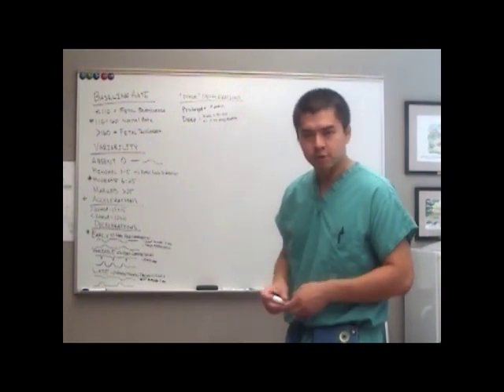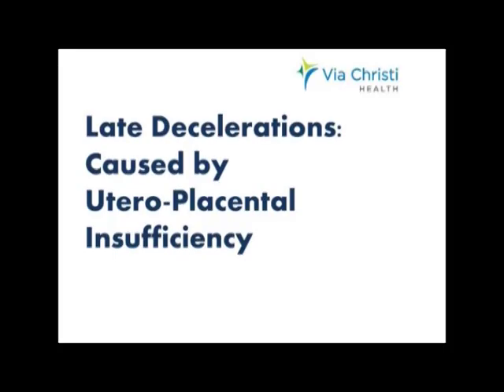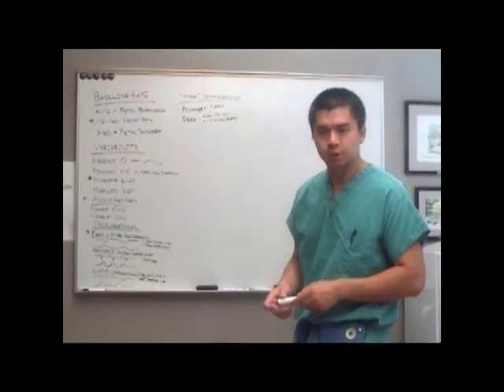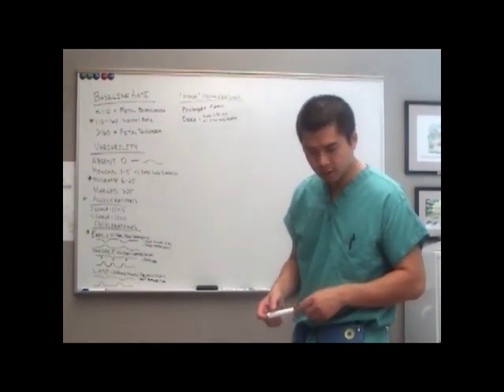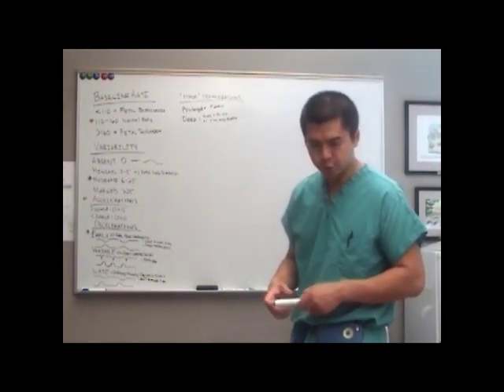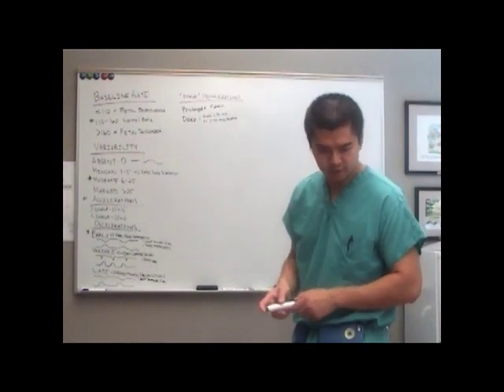What are late decelerations due to? Late decelerations are due to uteroplacental insufficiency. And so these are the most concerning decels that typically people worry about. And these are the ones that you want to intervene for.